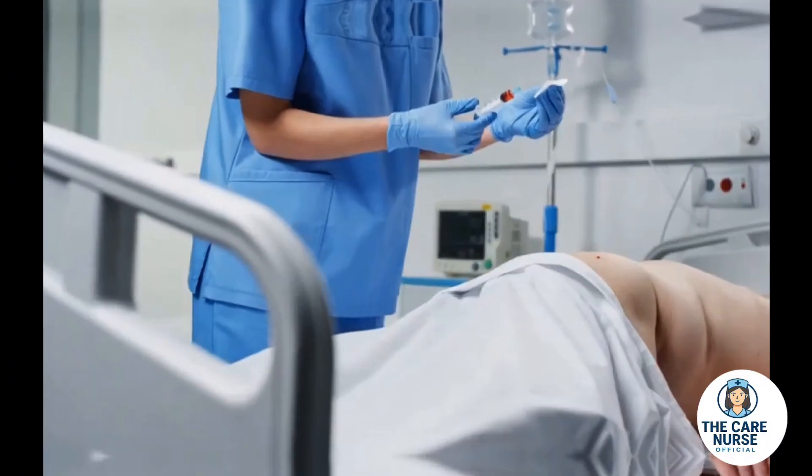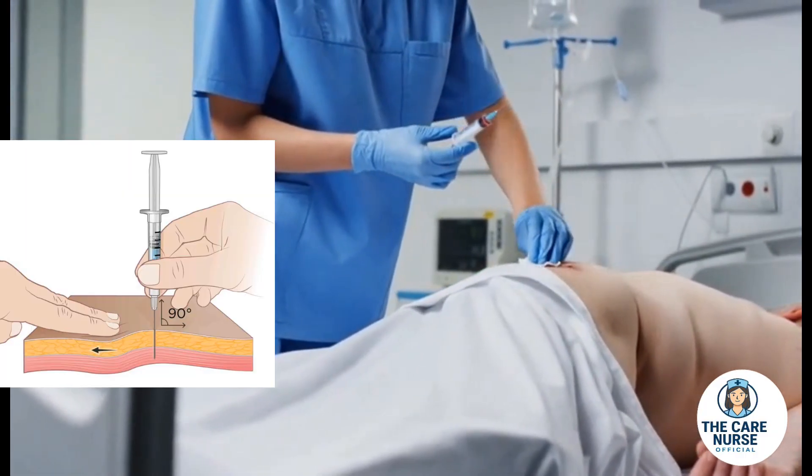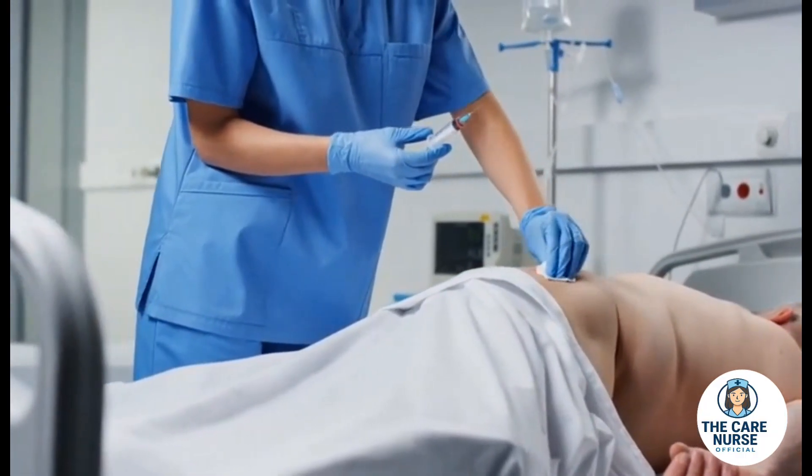The injection is administered by a trained professional at a 90-degree angle, demonstrating the correct technique with confidence.